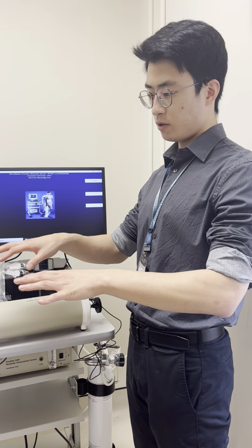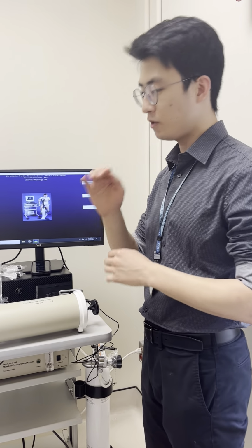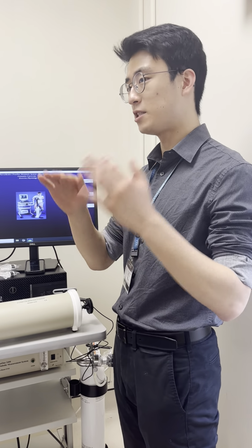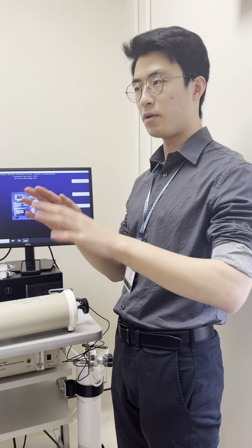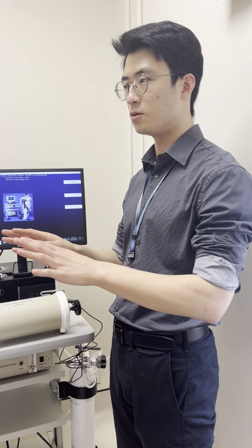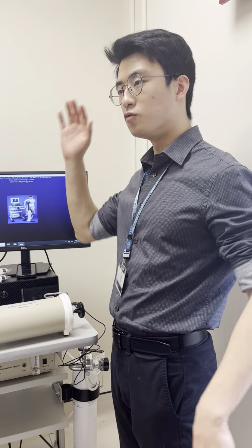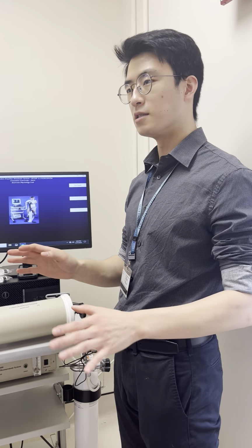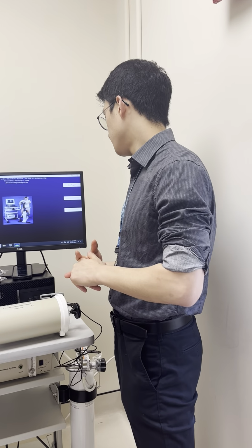Typically with the test that we're going to do, where it's very submaximal exercise, you may not see the respiratory exchange ratio rise at all. In fact, it may actually kind of fall, and this is sometimes what happens when patients exercise. It has to do with a lot of things, but a little variation is normal. When it goes really out of whack, below 0.6, above 1.0, then you should probably pay attention to that.